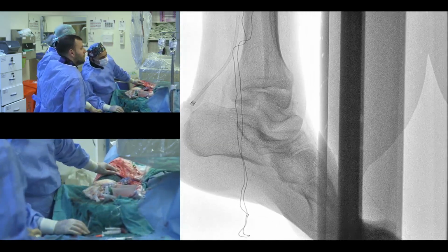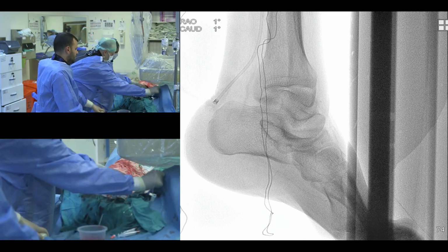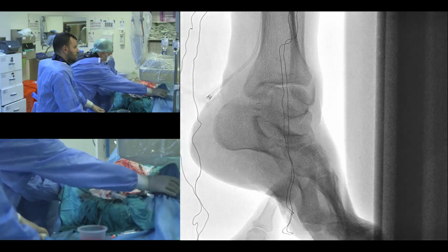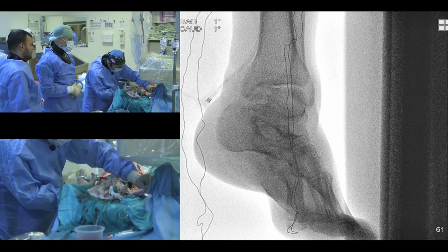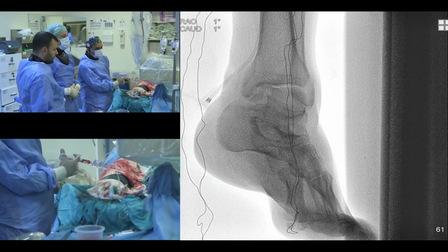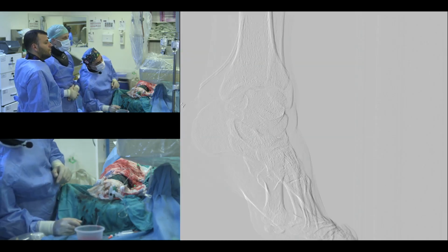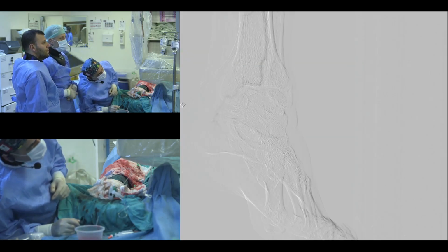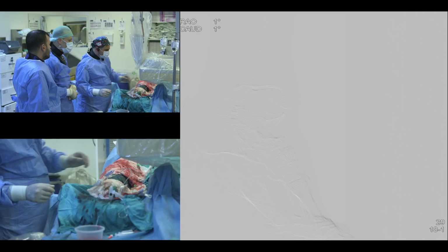Plaque modification, this is a Hawk 1S. S means a smaller cutter. So I will do atherectomy of the anterior tibial or the peroneal or the posterior tibial artery. I will use a chocolate balloon at low pressures for a 10-minute inflation, a little bigger than the vessel diameter. And then I will use a drug-coated balloon, 3 minutes, generously longer than the lesion. The problem is in the States, we don't have drug-coated balloons smaller than 4 millimeters. But I think in Turkey, you have drug-coated balloons smaller than 4. So this becomes a problem in the States. Hopefully in future, we'll get them available.